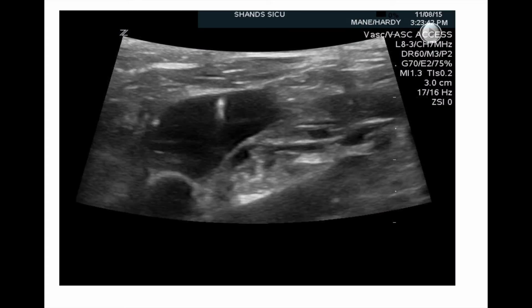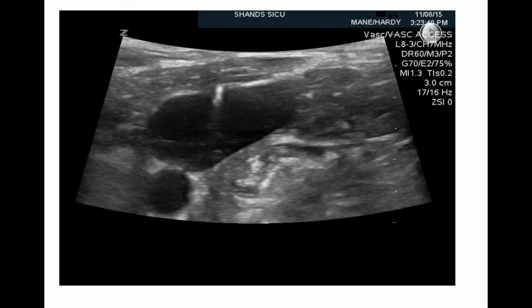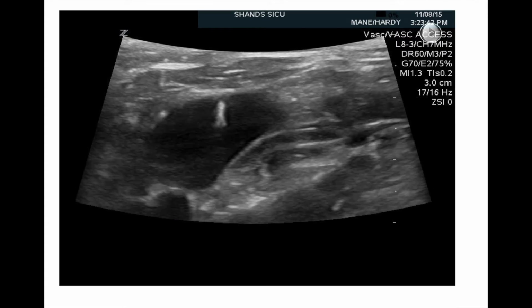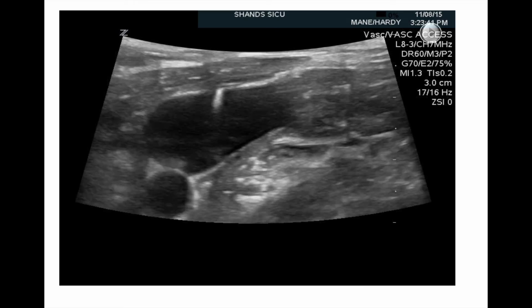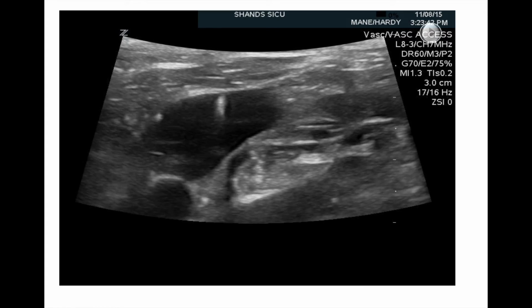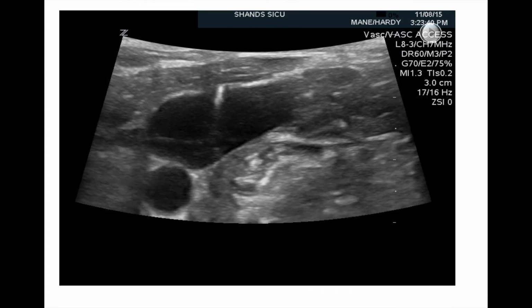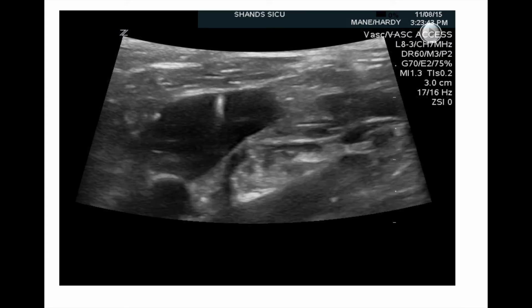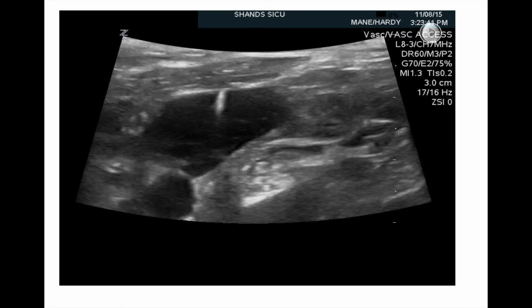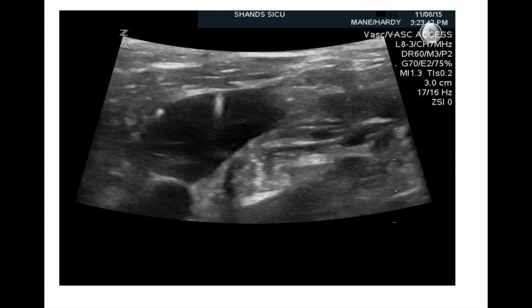This I just wanted to show you since you can see the guide wire going into the vein, but also on the left, you see a white speck. That could actually be air. I have seen that with neck internal jugulars from patients that have ENT surgery done. But also in the vein, you see a little thrombus on the bottom portion of the vein. Now, we can't tell for sure because we don't see the collapsing vessel here, but when this patient was being collapsed, it probably might have been collapsed partially.